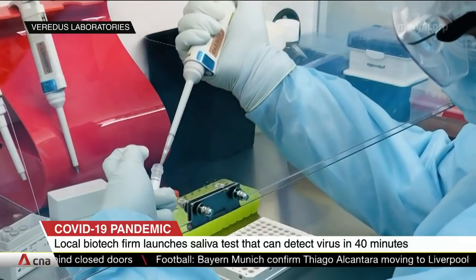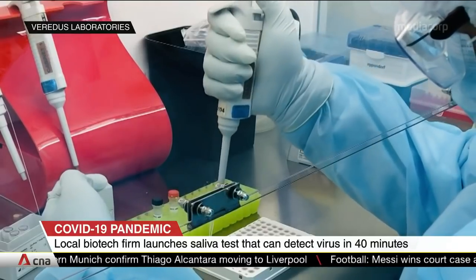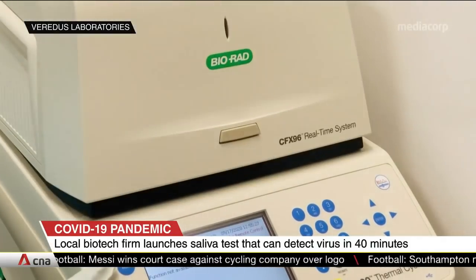Veritas Laboratories says it has the capacity to produce one million tests a week, and the non-invasive nature of the saliva samples will be key in mass testing. The test kit is currently pending approval from the authorities.